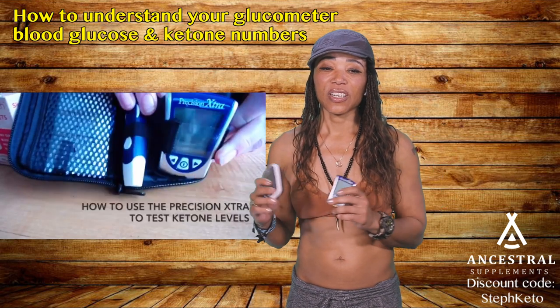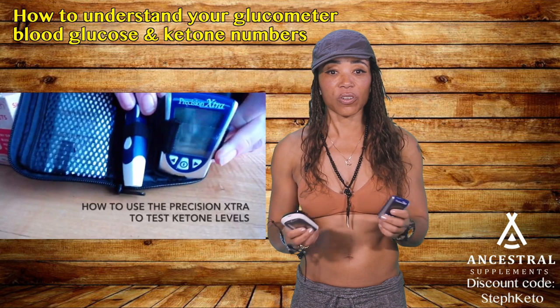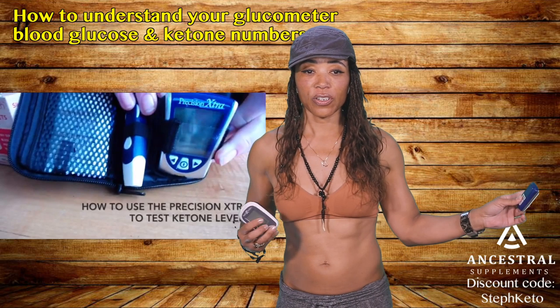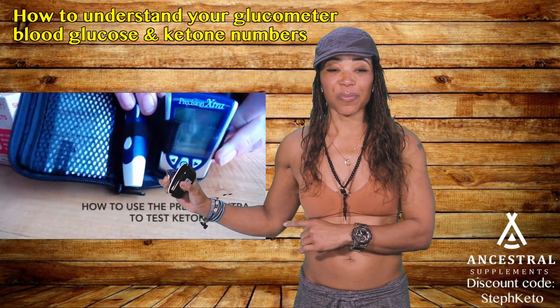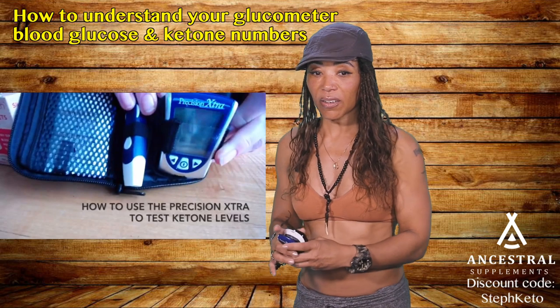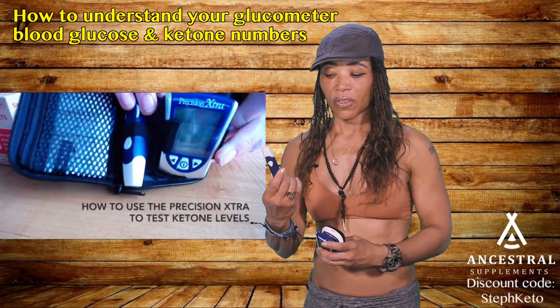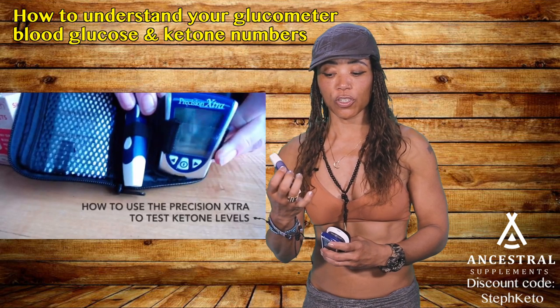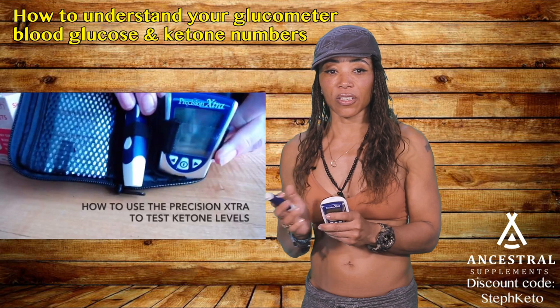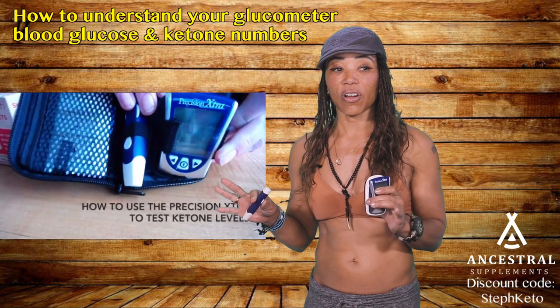These are the two most common glucometers. The Precision Xtra is this one here. The pen has a lancet — that's the needle — and it works just like a pen. You push it and get a little strip of paper that can measure either glucose or ketones. Both devices work the same way, using strips to register the numbers.